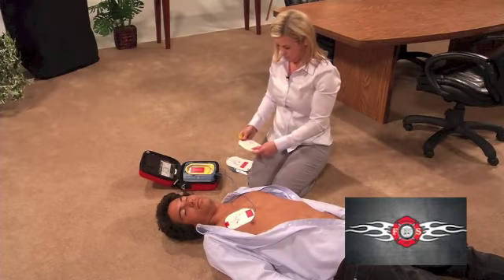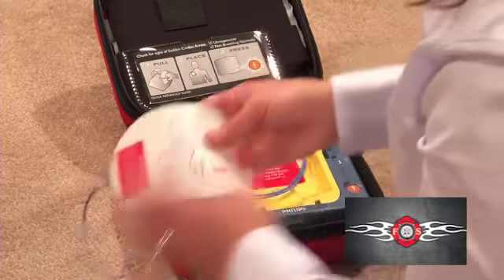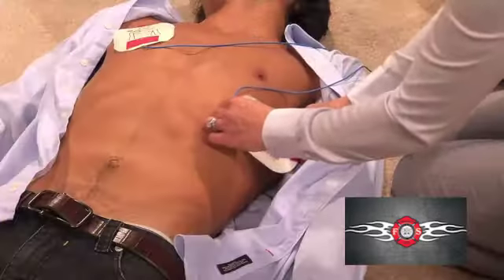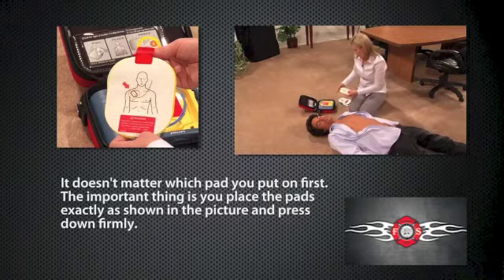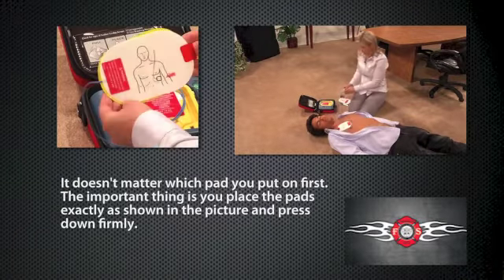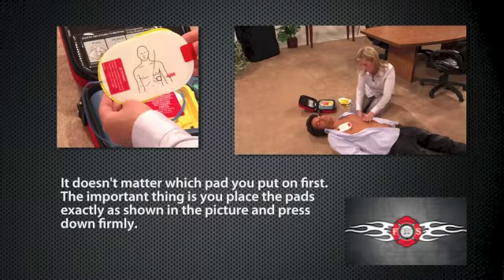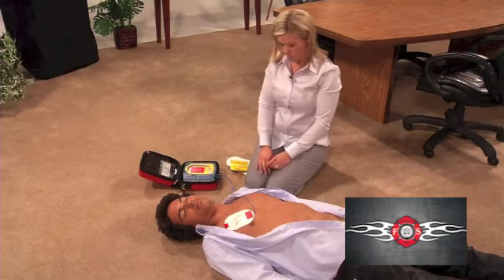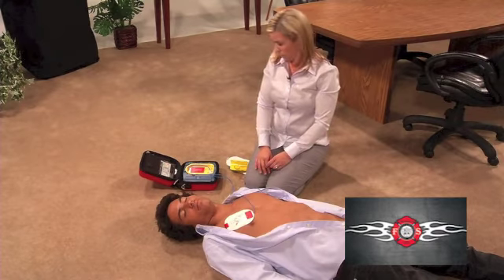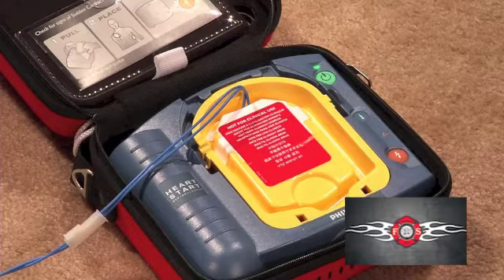When the first pad is in place, look carefully at the picture on the second pad. Press the pad firmly to the patient's bare skin. It doesn't matter which pad you put on first. The important thing is you place the pads exactly as shown in the picture and you press down firmly. As soon as the pads are in place, the AED will immediately start to evaluate the heart rhythm. No one should touch the patient.